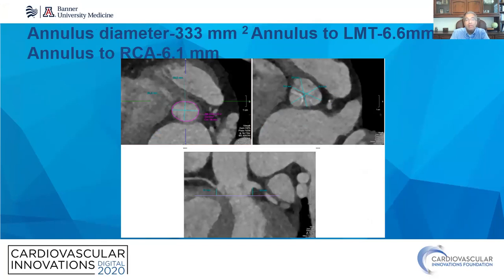automatically raise a red flag in terms of potential need for root enlargement and/or some kind of a situation where it sets her up for a patient prosthesis mismatch down the road, or at the very least, elevated gradients at the conclusion of the procedure.